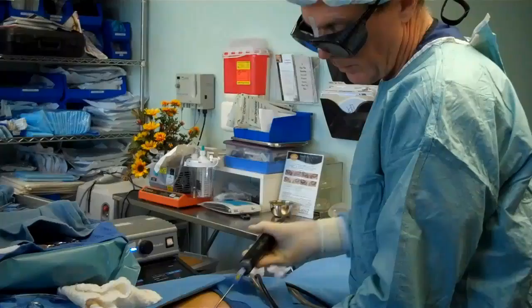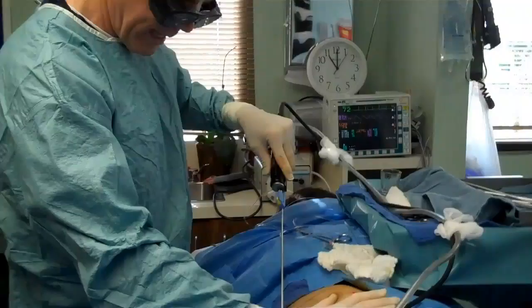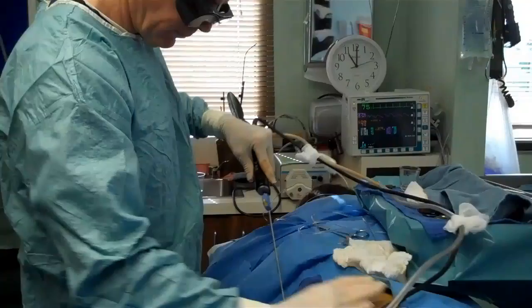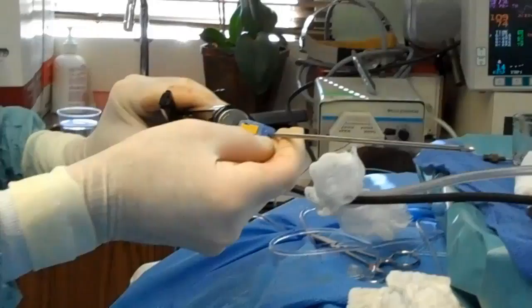How are you doing? All good — no pain. You'll need to wear a compression garment afterwards. It's really important to have a girdle that fits nice and snug so that as it heals it'll be nice and smooth without any ripples. It's still nice yellow fat with no blood at all. This cannula is only three millimeters in diameter — pretty small.